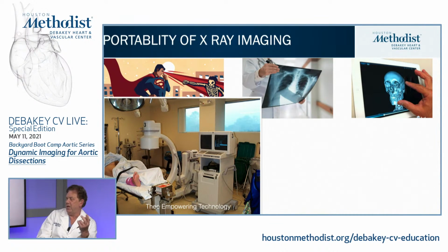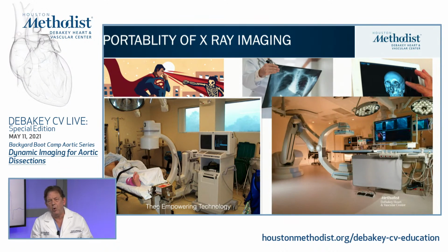I always say the first, second, third rules of endovascular surgery are imaging, imaging, imaging. And yet, we don't teach imaging very well. In fact, there are hardly any lectures on imaging. It's all kind of expected that you pick it up as you move forward. And this is our old hybrid room. We've now moved into what are called new pheno rooms.